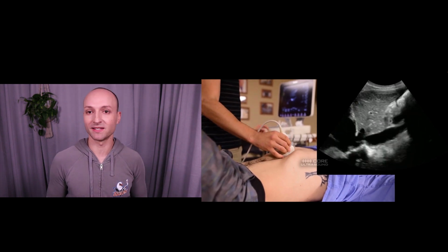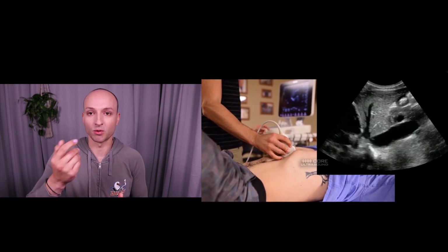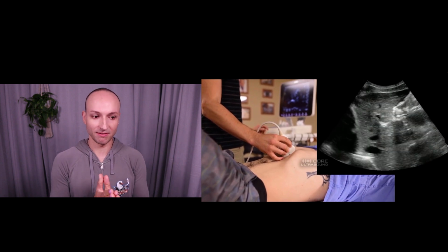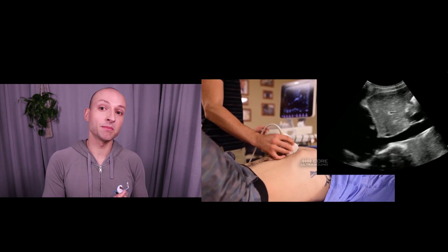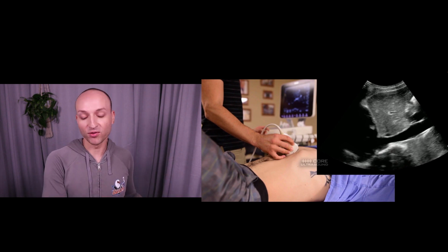Now, let's move on to the IVC. I think this is one of the ones that could be easier to get as long as your patient isn't fluffy. They don't have a bunch of bowel gas or something getting in the way of that IVC. The way you get this is you use a phased array or a curvilinear transducer. You place it in the subcostal window, probe marker facing up if you're in a non-cardiology setting, or probe marker facing down if you're in a cardiology setting. And what you're doing is you're observing the IVC as it moves through respiration. And what you want to do is find the maximal diameter and the minimal diameter and use that to figure out percent change to guide fluid management.